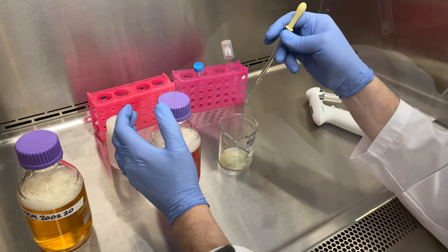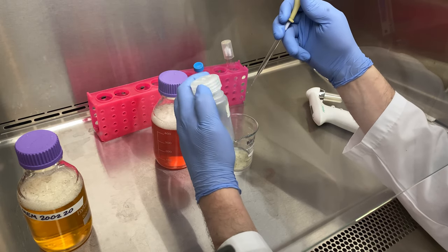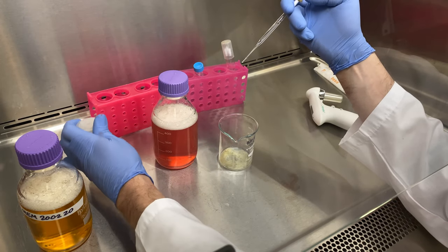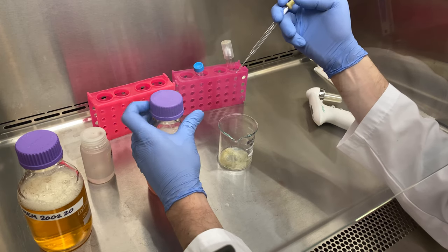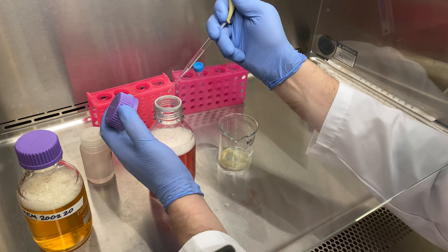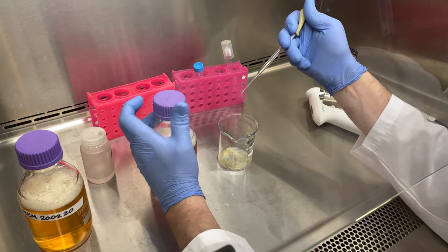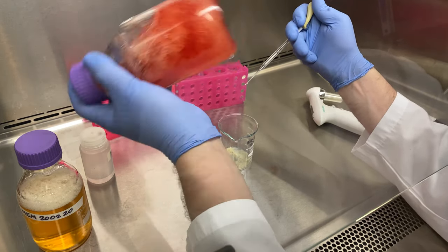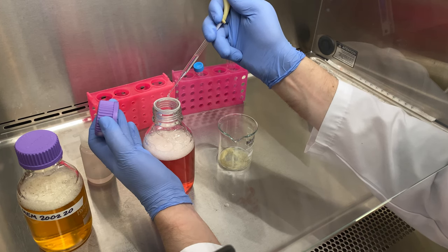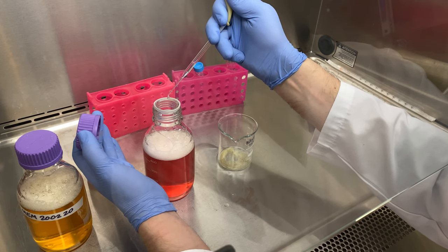We don't want orange, we want cherry red. But don't add too much that it turns pink. So we're at 40 drops, and I continue adding drops — up to 62 drops. It's getting closer to cherry red, but I still see some orange, so I'm going to add a little bit more.